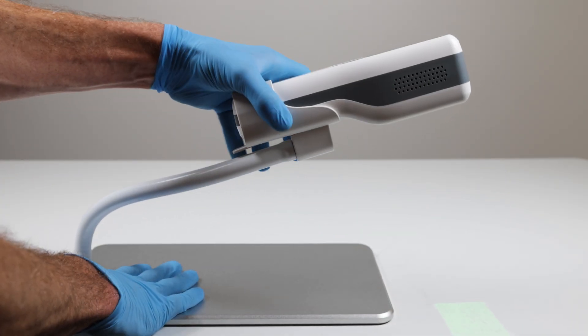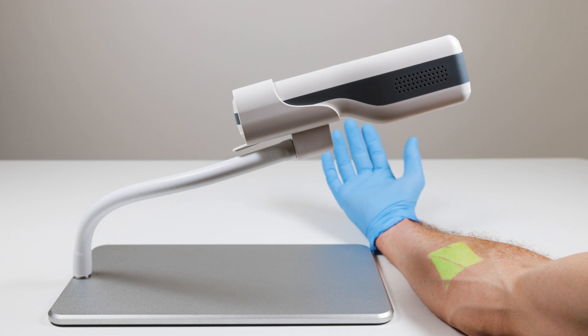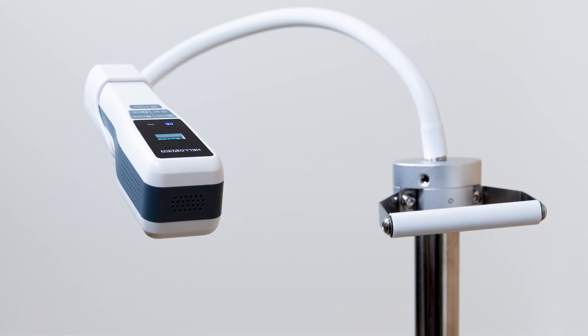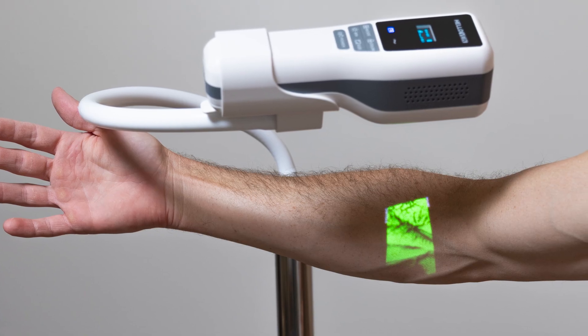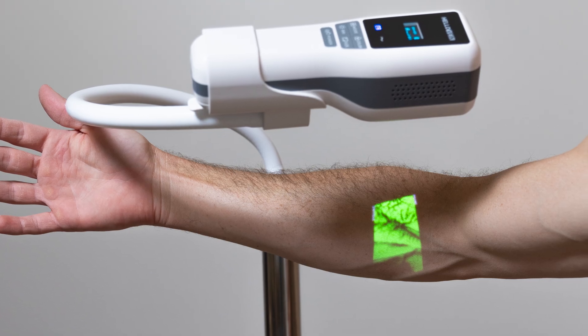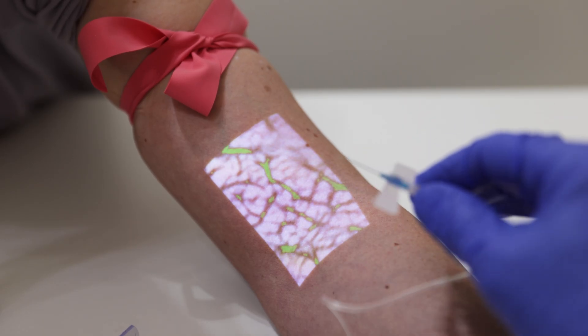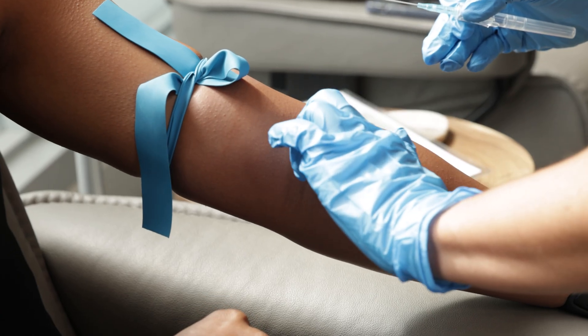There are hands-free accessories available, such as the benchtop stand so you can place it on a table and have the patient put their arm underneath. There's also a mobile stand — essentially a cart on wheels with a flexi arm that you can move around quickly. Both options are useful when doing an IV start or blood draw.